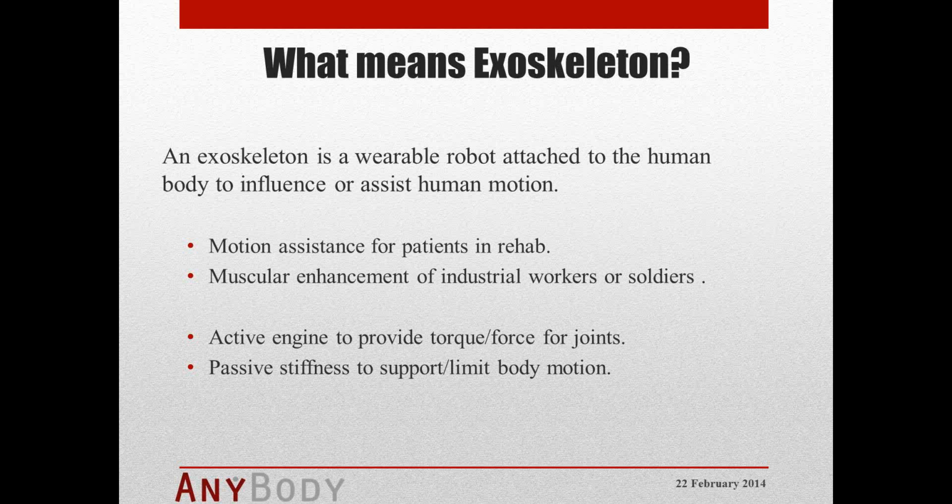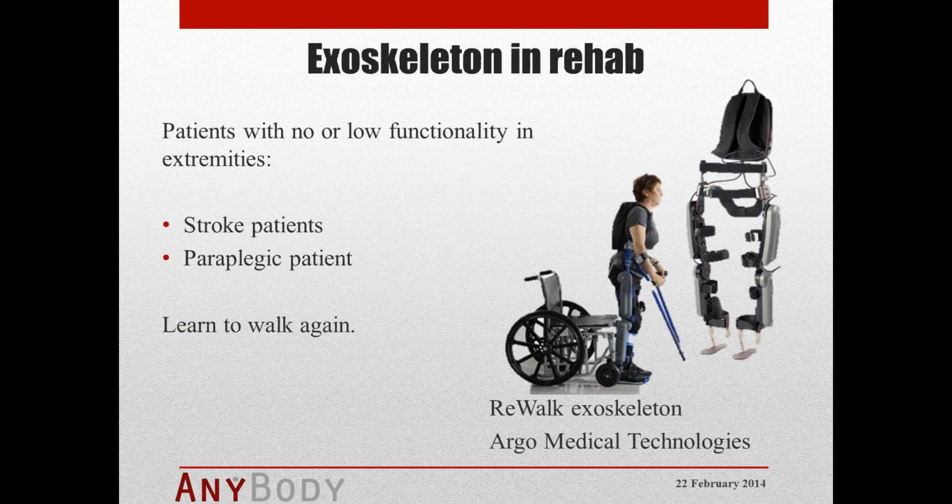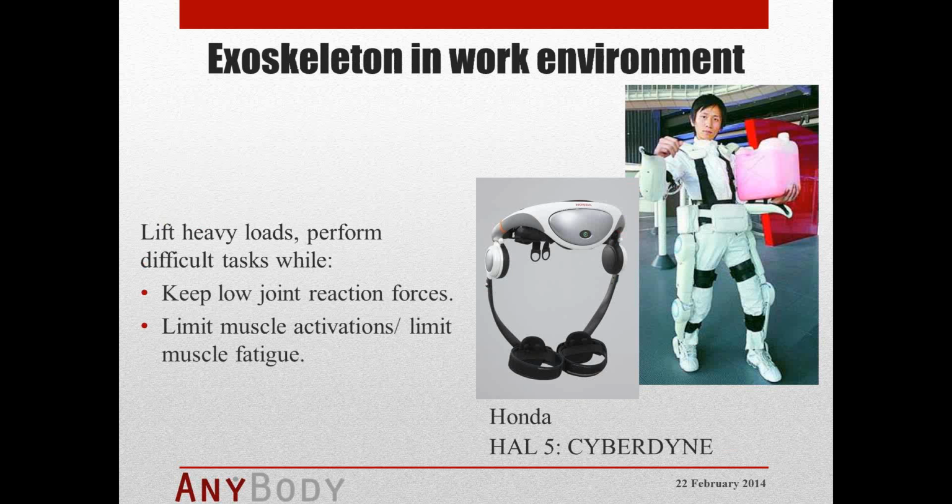So I have prepared a couple of examples. That is not directly related to Anybody now, but a very famous and very good exoskeleton in the rehab area is the ReWalk exoskeleton that is used for patients with no or low functionalities in the extremities, especially in the lower extremities. So if you have stroke patients, for example, or paraplegic patients, they can learn to walk again with such an exoskeleton.